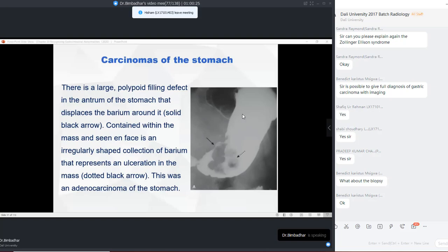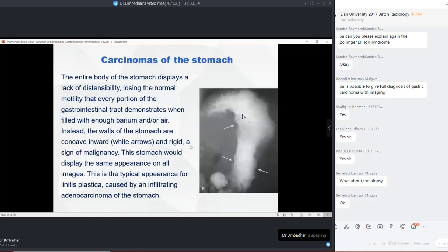These radiological signs that you are looking at are dependent upon the dispersion of the barium, the type of erosion, and the type of collection or dispersion. Simple, right? I think you understood that the radiographic changes do not completely give you the etiological origin, but will certainly give you information related to the typing. Okay, right.